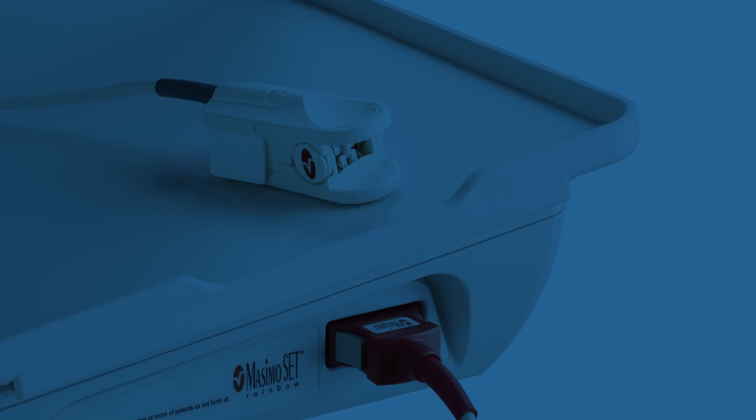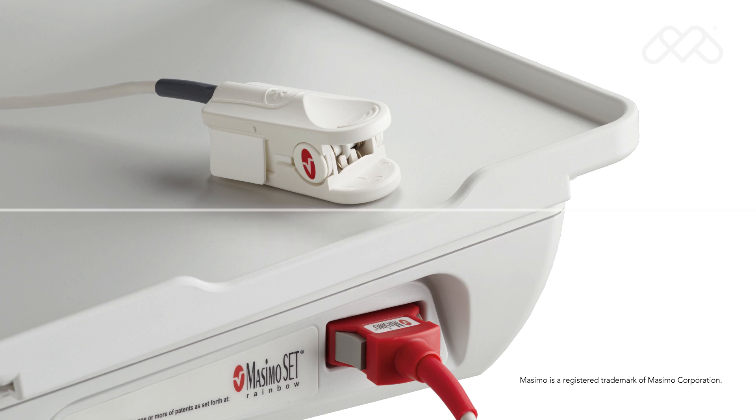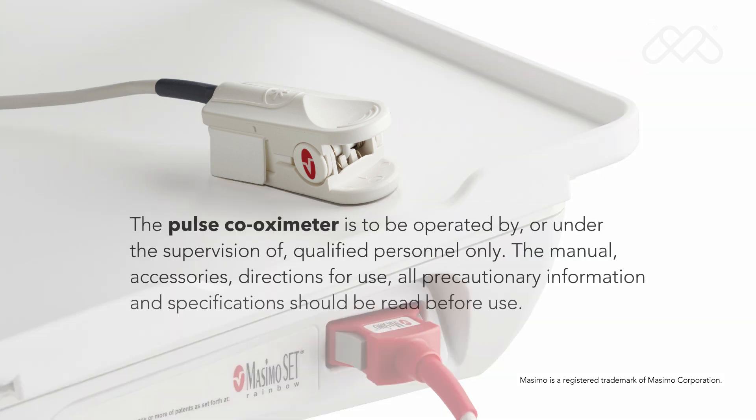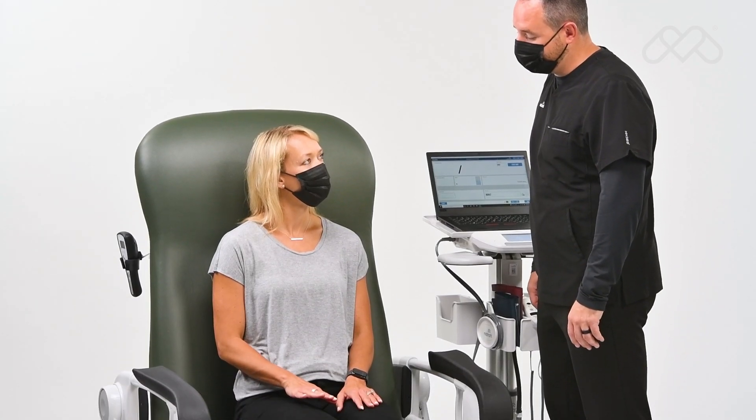Masimo SpO2: Masimo pulse co-oximeters deliver accurate pulse oximetry during motion and low perfusion. The pulse co-oximeter is to be operated by or under the supervision of qualified personnel only. The manual, accessories, directions for use, all precautionary information, and specifications should be read before use.